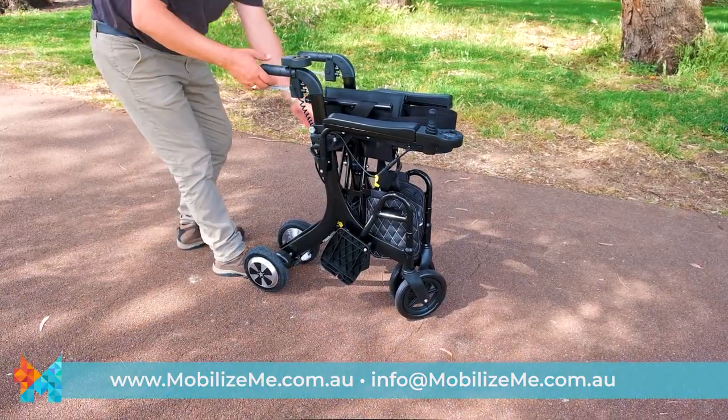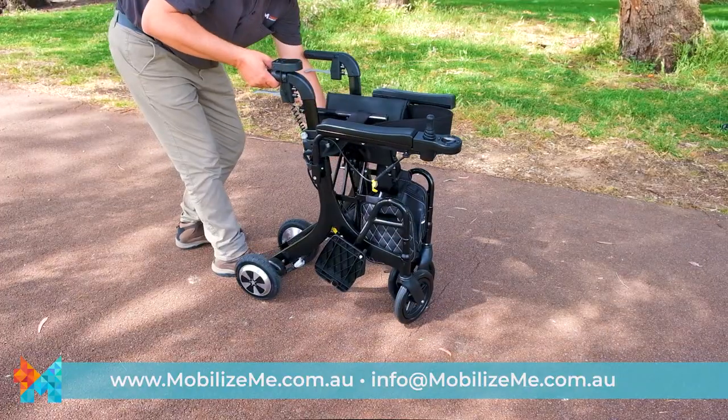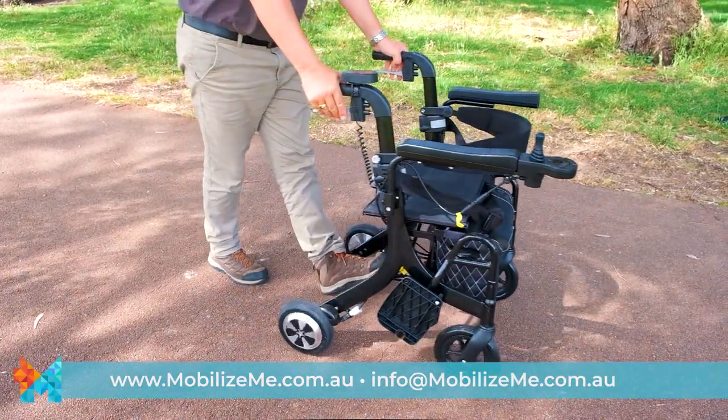To unfold, ensure the little latch is undone and pull the Evo apart, pushing down on the seat to ensure it's locked in. The Evo is now ready to go.